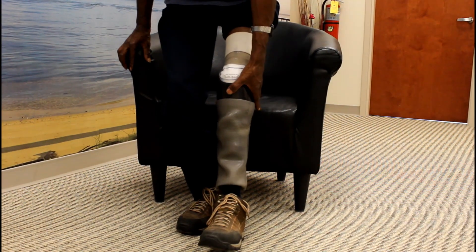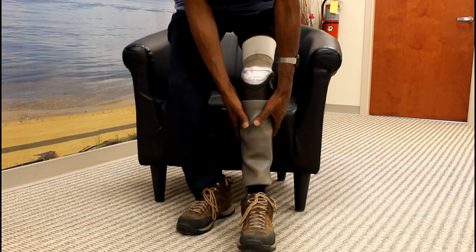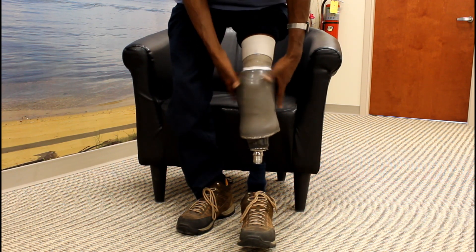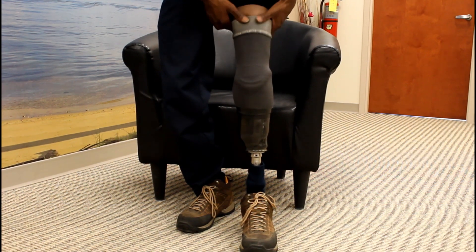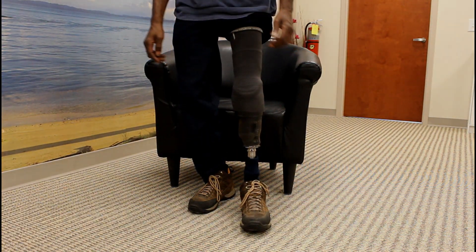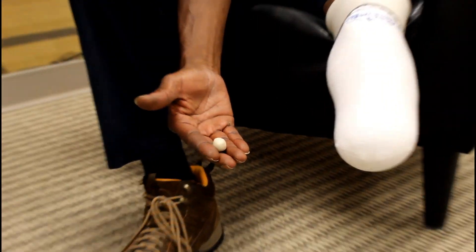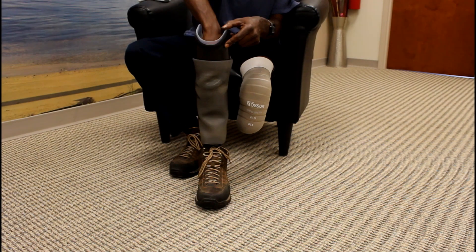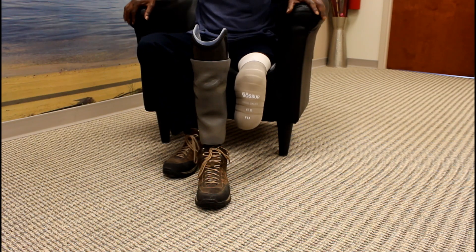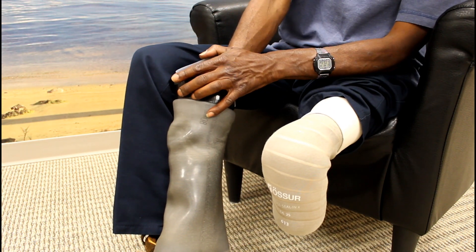How do you know how many socks to use? Similar to the pin system, your prosthetic should be comfortably snug. You can add or remove socks to find this comfortable zone. If the prosthetic is too loose or too tight, pain and discomfort can occur. Socks are the way you dial in the perfect fit. Be careful not to add so many socks that you are lifted off the bottom of the socket. This can be checked, if desired, using a clay ball as demonstrated here. The clay is flattened when full contact occurs and this is a sign you are all the way in the socket.